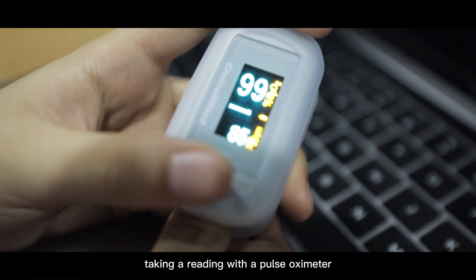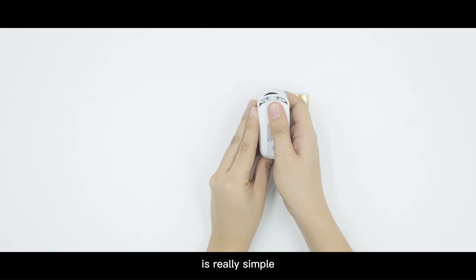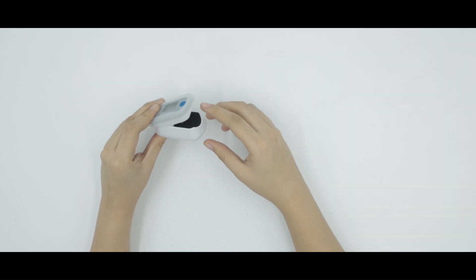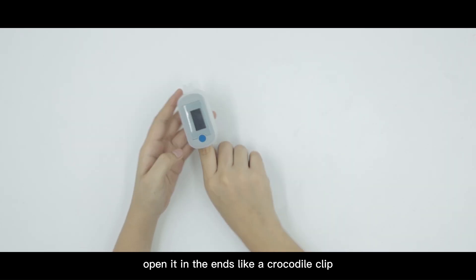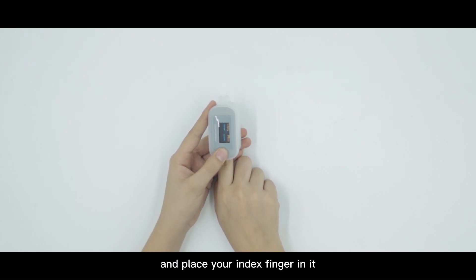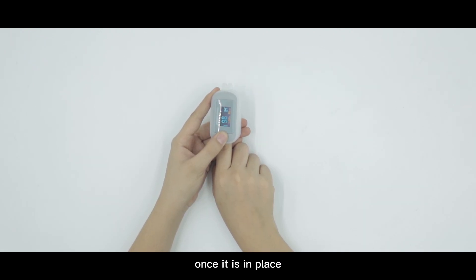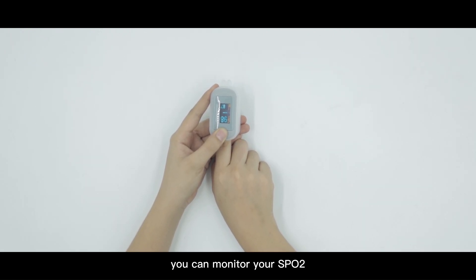Taking a reading with a Pulse Oximeter is really simple. Just remove the battery tab and insert the batteries, open it at the end like a crocodile clip, and place your index finger in it. Once it is in place, you can monitor your SpO2 or blood oxygen levels.